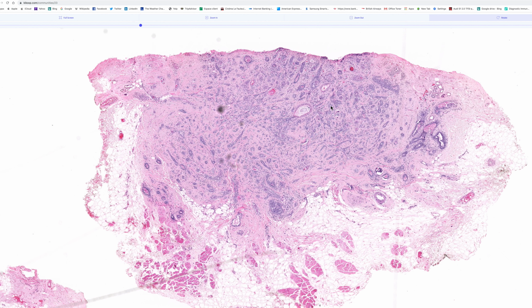Now, keratocysts, narrow epithelial strands, one thought is microcystic adnexal carcinoma. A common differential is desmoplastic trichoepithelioma. Now, this cannot be desmoplastic trichoepithelioma for two big reasons. One, we know there's glandular differentiation. Well, you don't see that in desmoplastic trichoepithelioma. And secondly, the tumor is going down to subcutaneous fat, which is not a feature of that tumor either. So I think we can forget about desmoplastic trichoepithelioma.